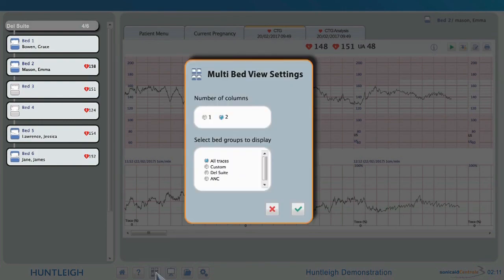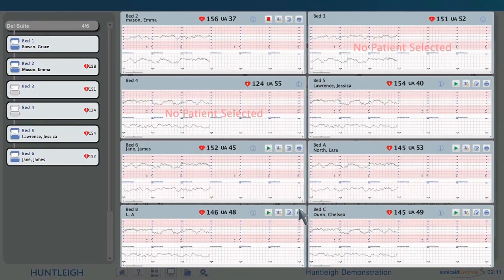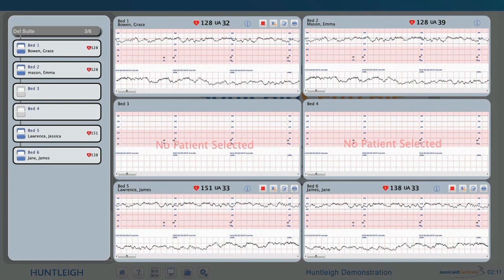An overview of all active beds with CTG traces running can be displayed by selecting the multi-bed view and selecting traces from all wards, or any one or more of interest. This view changes dynamically, scaling automatically to show active CTG traces selected by the bed group profile. If a CTG is switched off, the trace will disappear from the selection, or if a CTG is switched on, it will be added automatically. Here we have used a bed group profile to show only the delivery suite and the active beds for that area only.